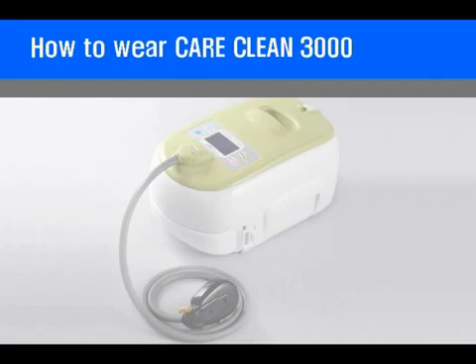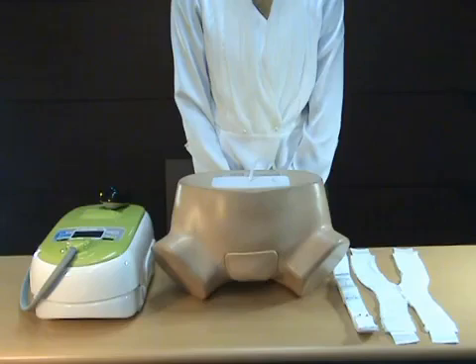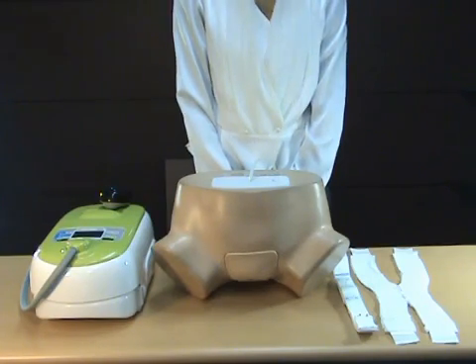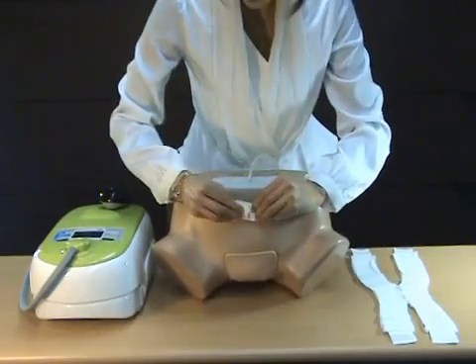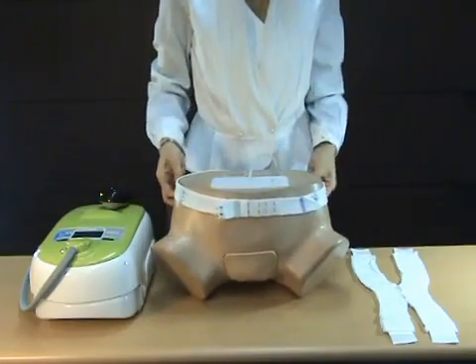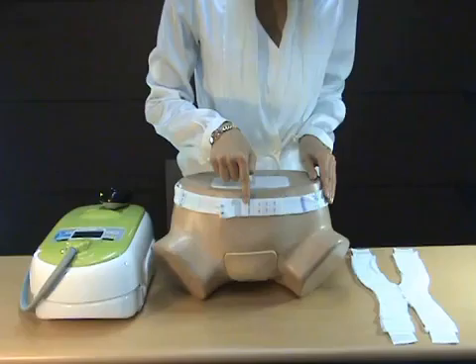Let's take a look at how to wear this device. First, put on the back waist belt. Fit the belt on the upper side of the pelvic bone to prevent it from slipping down.